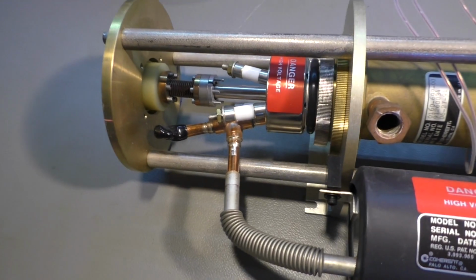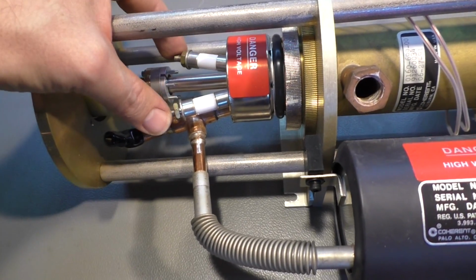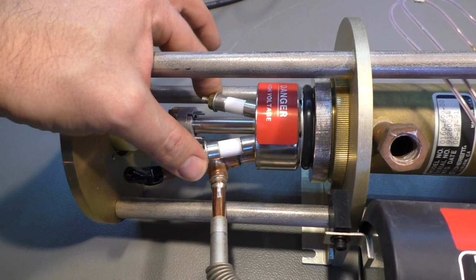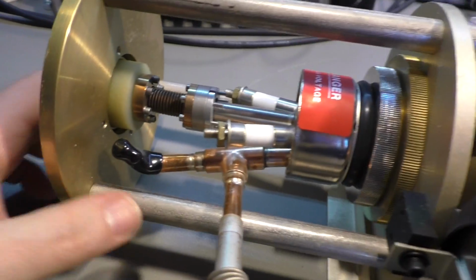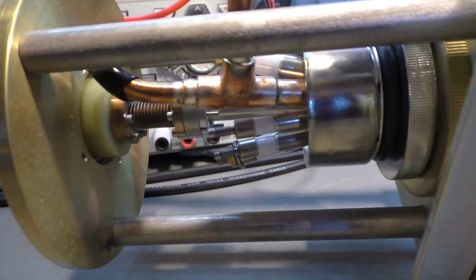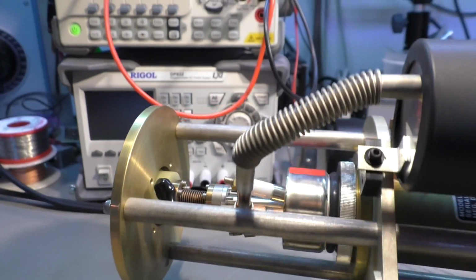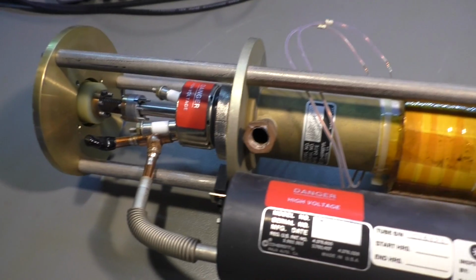Then we have here the cathode with 2 terminals for the heater, the filament. The other 2 terminals you can see, oops, it's a little bit heavy for one hand. The other 2 terminals down here were not connected. I have no idea what they are good for.